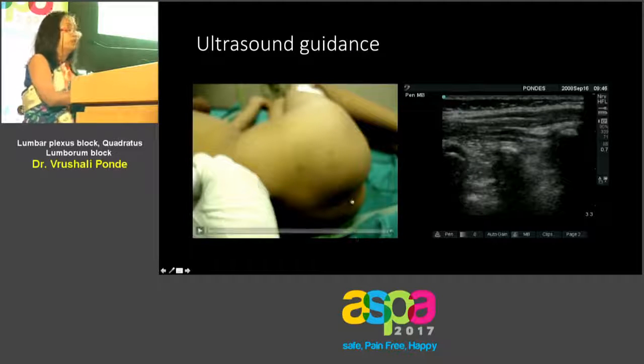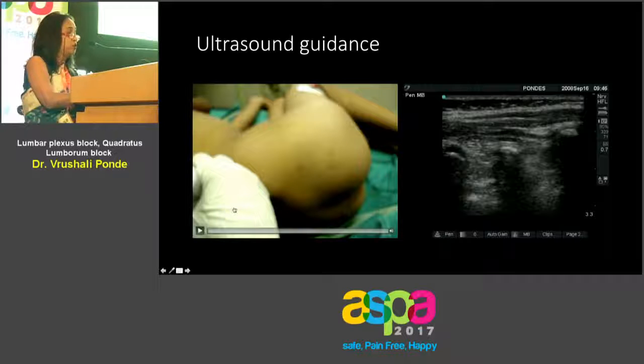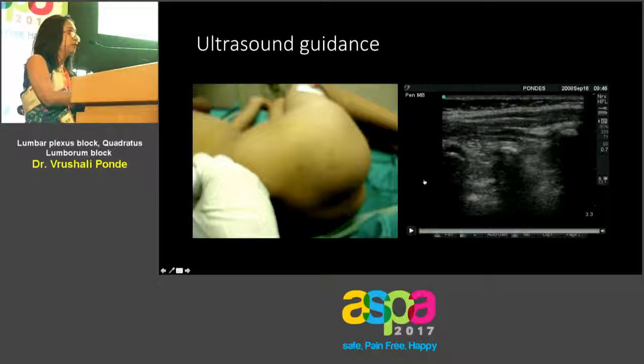Well, we could give ultrasound as well, because ultrasound definitely is going to show us the trajectory, but is not going to show us the end point of injection, which usually it does, but in this particular case, perhaps not. So definitely ultrasound can tell us about the trajectory. If you really ponder a bit on this image, we can see the transverse processes. Manoj very fondly calls it a trishul, and in between, amidst the two, we will see the muscles here.